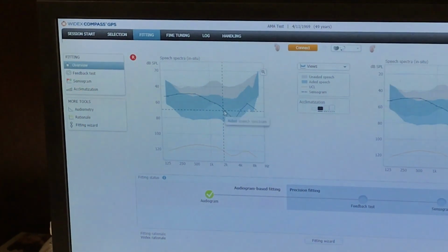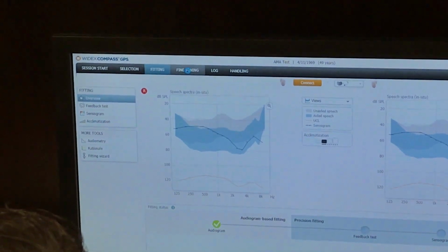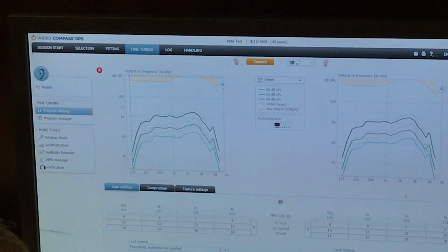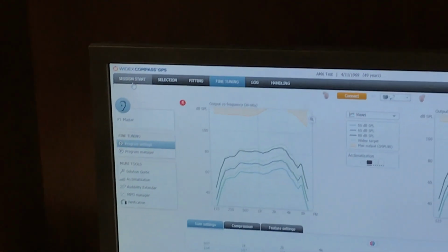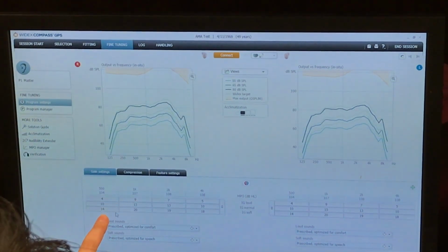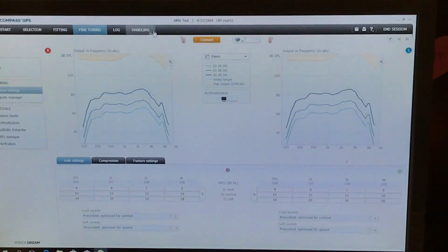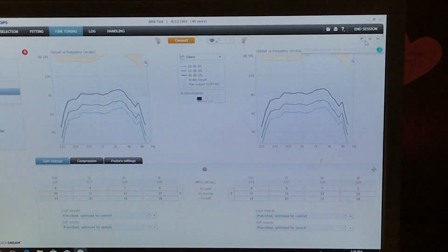The sensogram is their fitting formula. Can I change that fitting formula? Let me see. If I go into fitting, fine tuning, it will give me... Can you not just select them like Oticon and then up it? Oh no, but I don't want to adjust it. I want to change my prescriptive formula. Okay, so how do I do that? It should be under this thing called preferences.